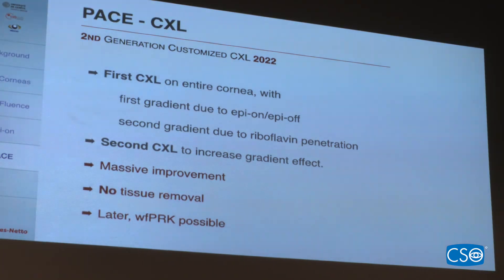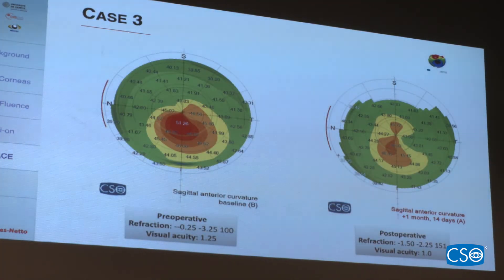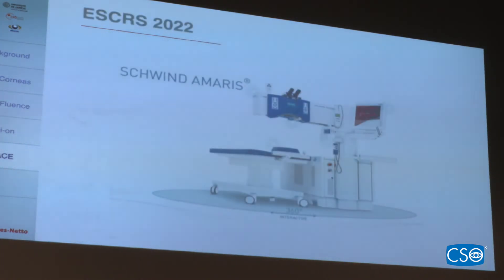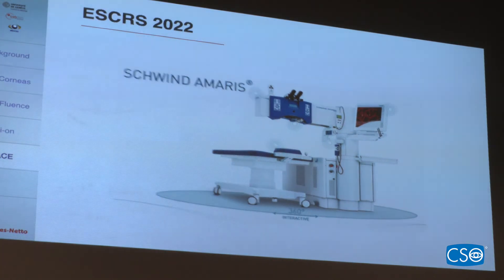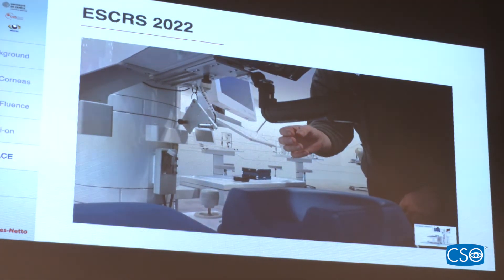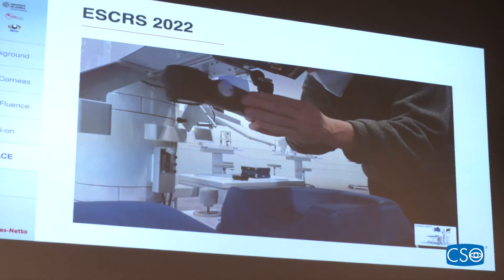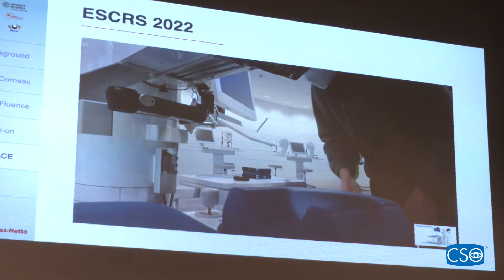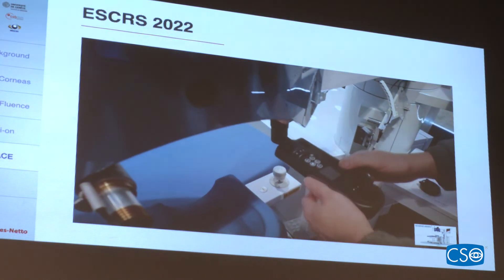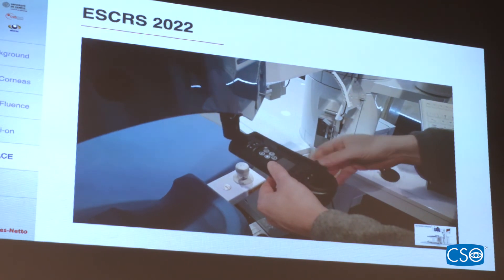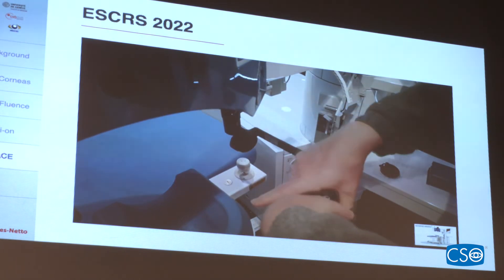The news this year is that the CI device can now also be coupled with the Schwind Amaris device. You can see how easy it is to use them together — it will be available for users of the Schwind laser platform, adapting easily to the laser.